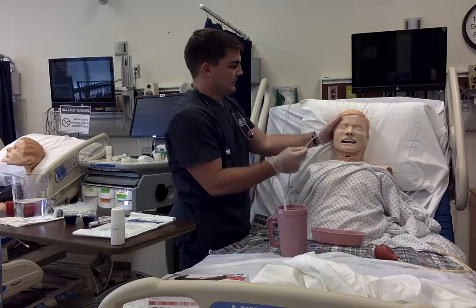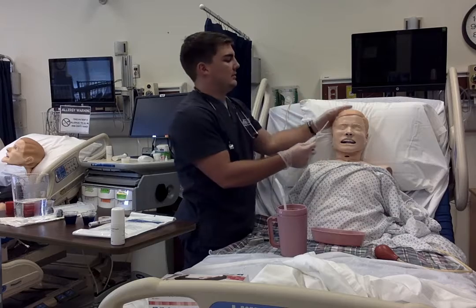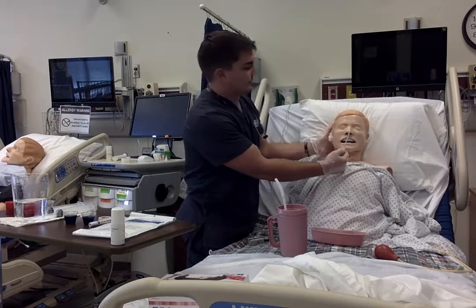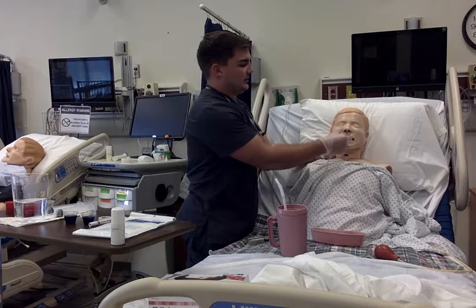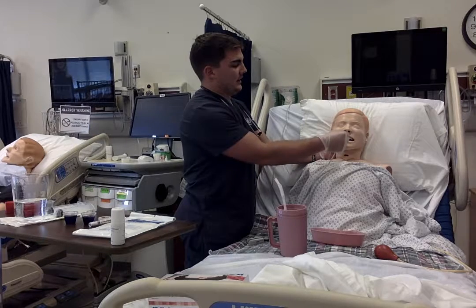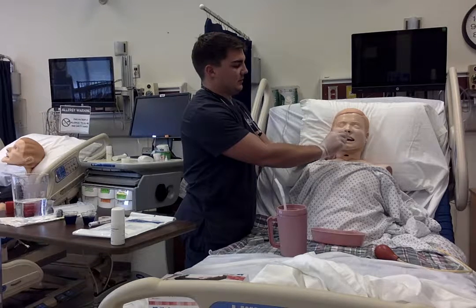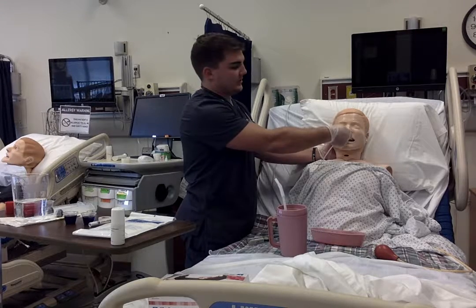I'd have the patient tip their head back for patent nares, and then hover in their neck and tell them to take a deep breath and insert. As I go past, the patient could feel irritated, and as I hit the oropharynx, I can start rotating the tube towards the opposite nare.